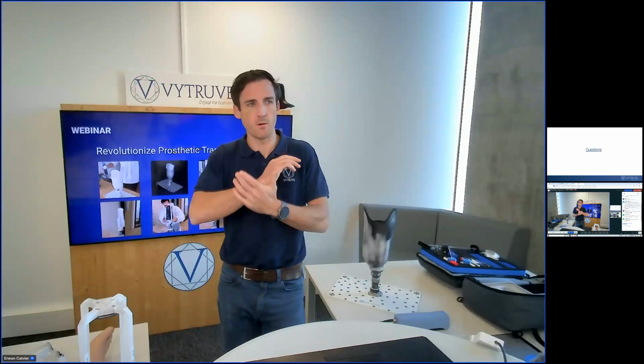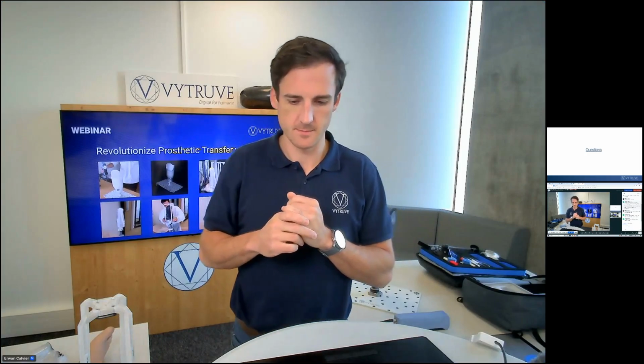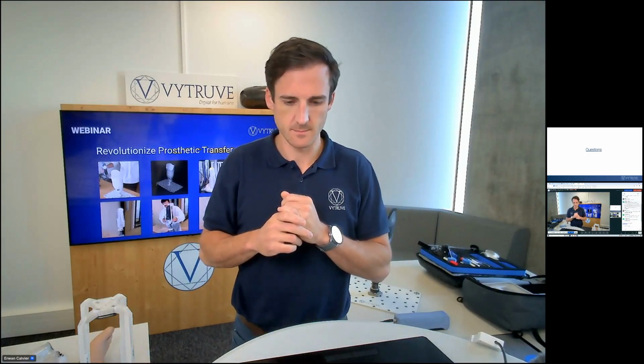So, do you have other questions? Scan, software, 3D printer, patient, fitting. We can talk about everything. So I think it's okay.